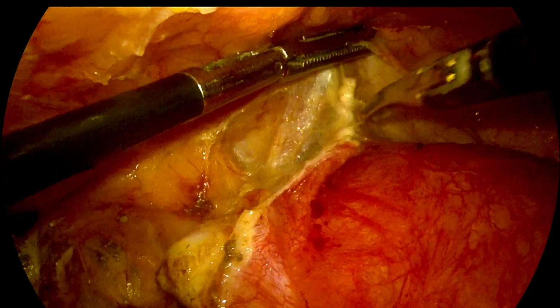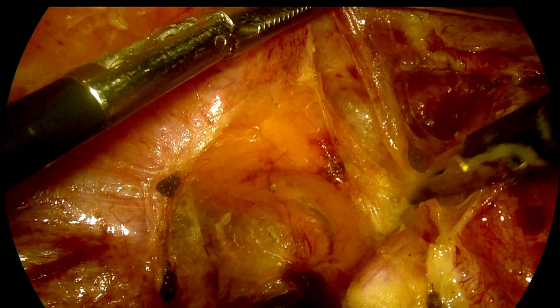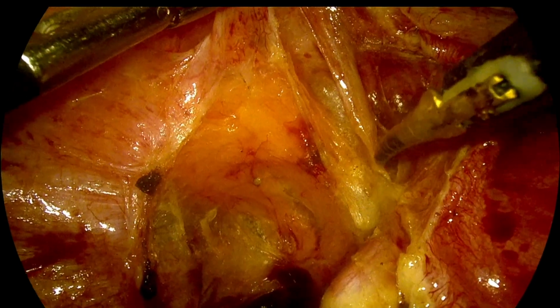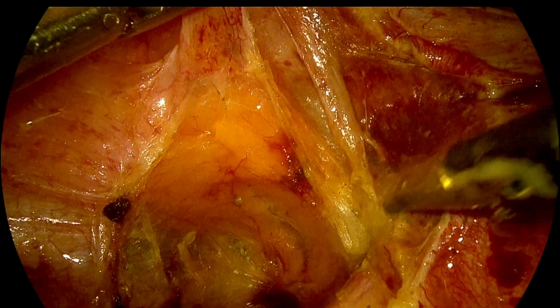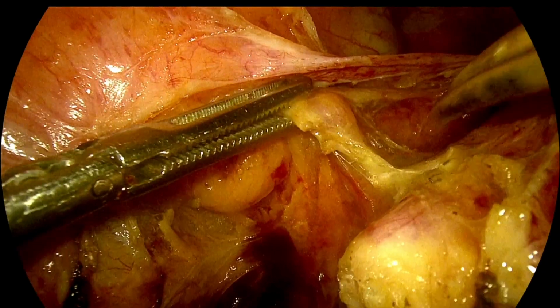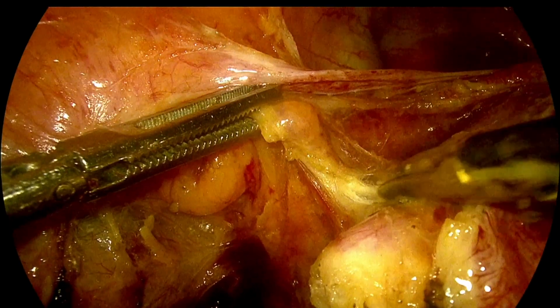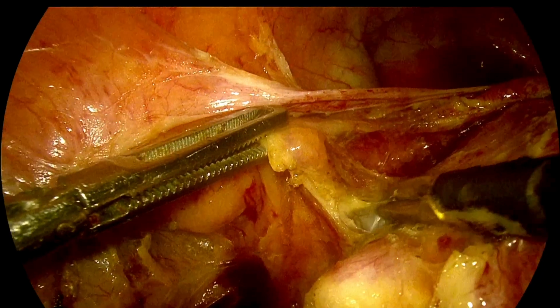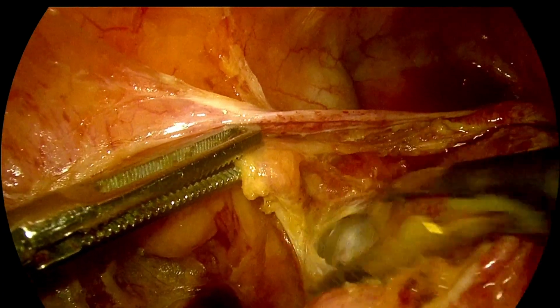So keeping that in mind, we are going to divide proximal to the fat plane, keeping the fat laterally towards the bladder, and try to identify the plane between the uterine vessels and the bladder. We are trying to identify the plane between the bladder and the cervix so that it can be separated.